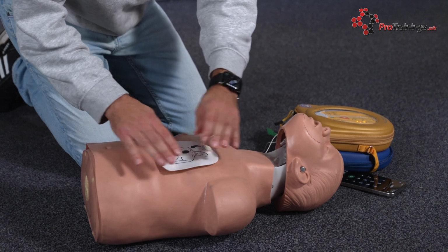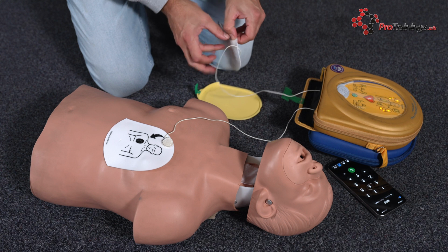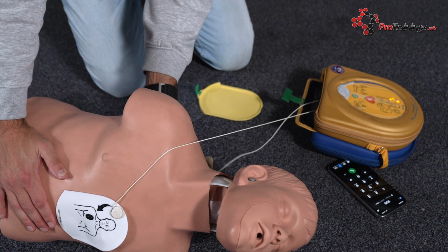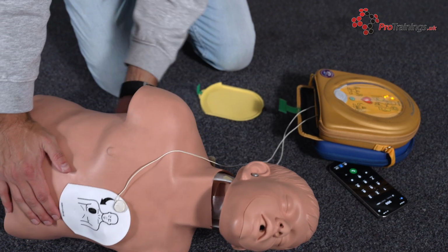Make sure the child's chest is bare and dry. For children under roughly 25 kilos or about 8 years old, place 1 pad in the center of the chest, slightly to the child's left side. Place the other pad on the back between the shoulder blades. This offset front and back pad placement ensures the shock passes through the heart.